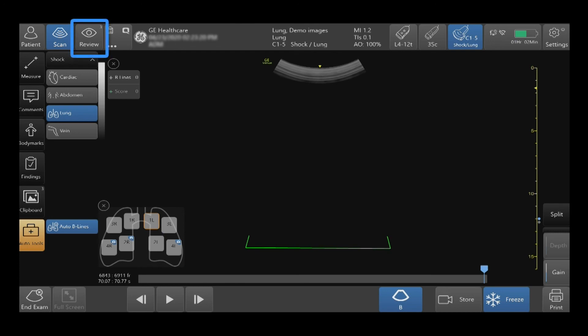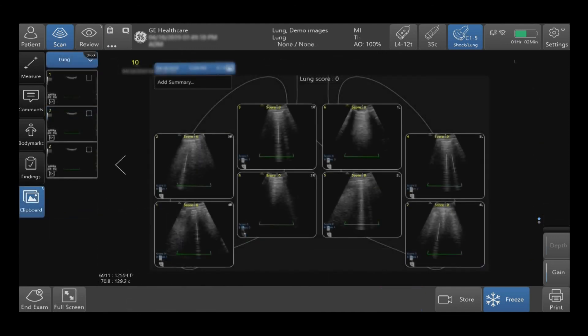To review the lung segments, tap Review at the top of the touch screen. Here you will be able to review all the lung segment images with the B-Line score in a single diagram. If you choose to store the lung diagram as an image, tap Store on the bottom right hand side of the touch screen.